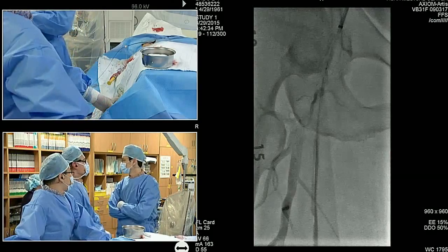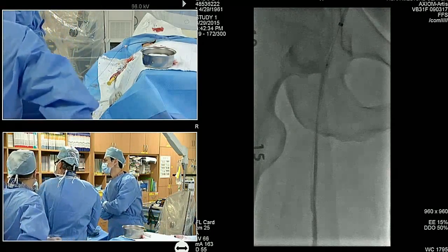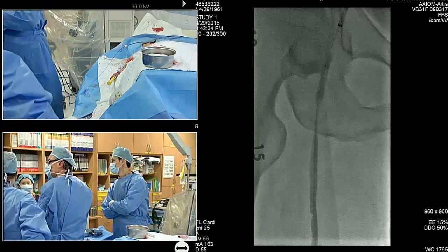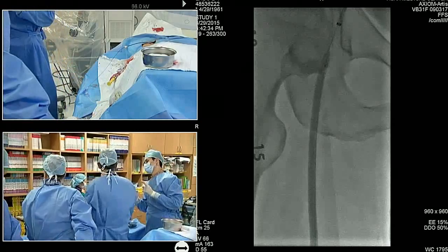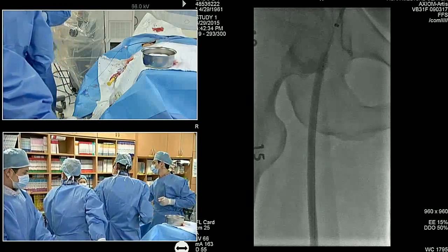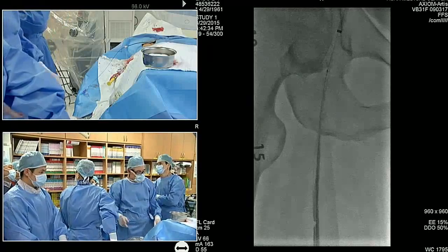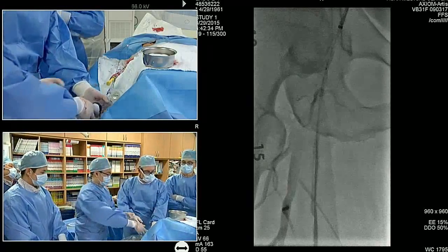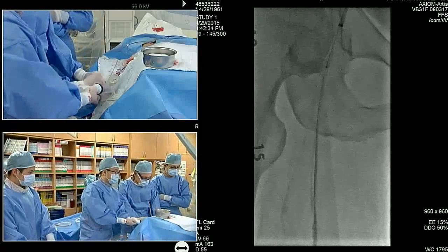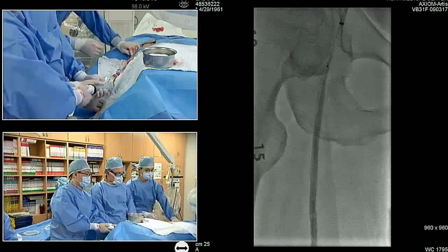But what stents would you like? What are the choices? Well, we'll see. We'll take a picture. There you go. Okay, coming down. Well, let's take a picture and decide. Hold this sheet, if you would.